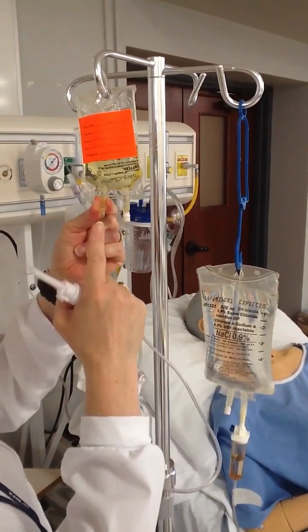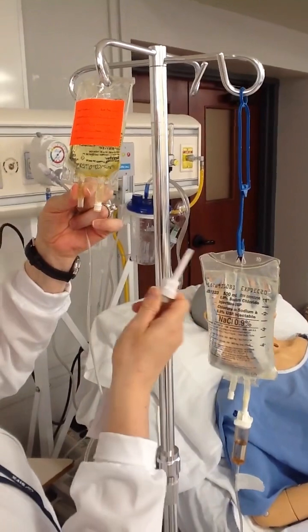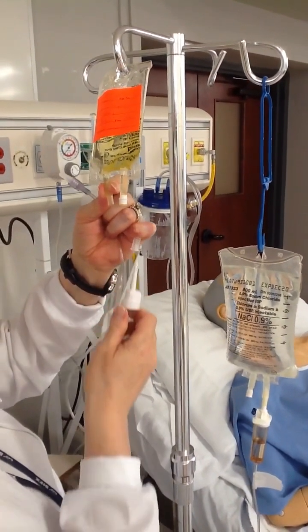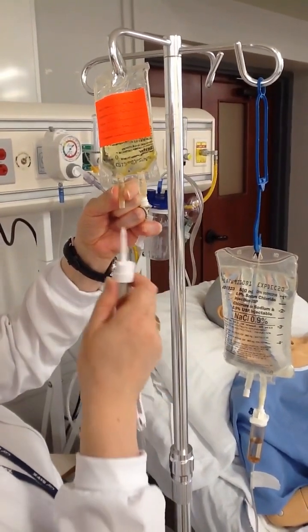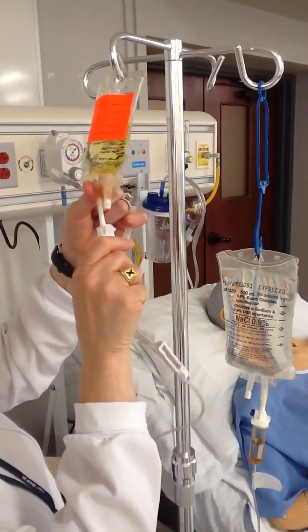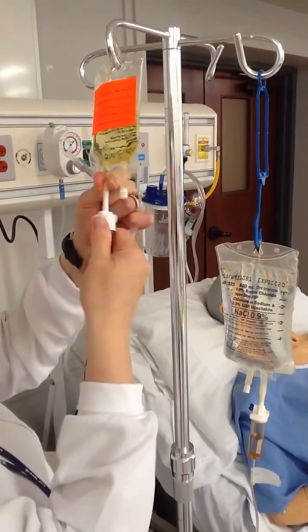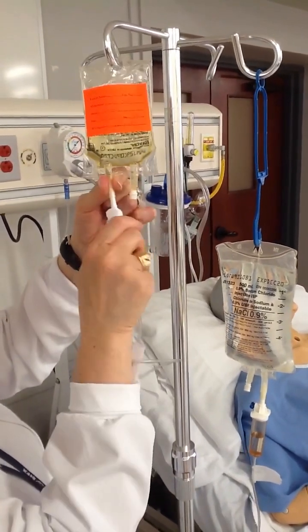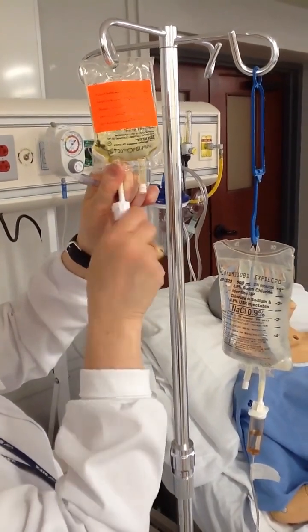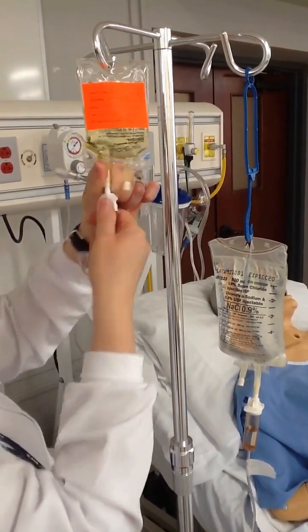So that's sterile. Nothing can touch that except something sterile. I'm reaching this hand in behind me where it's free. I'm going to pull that spike off. Just be careful. Maintain the sterility of that spike. And I'm just coming into that port. I'm keeping everything nice and straight. And it's a push and twist. So at the same time you're pushing, you're twisting. You can see a little bubble. That's when you break through the little membrane that's there. Push that on all the way. Use your muscles. There.